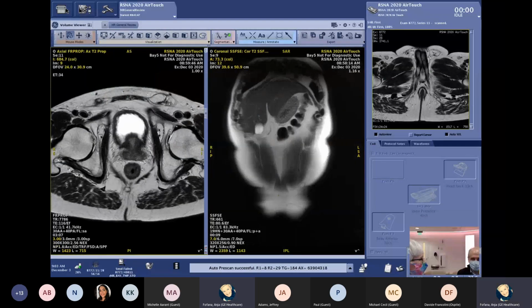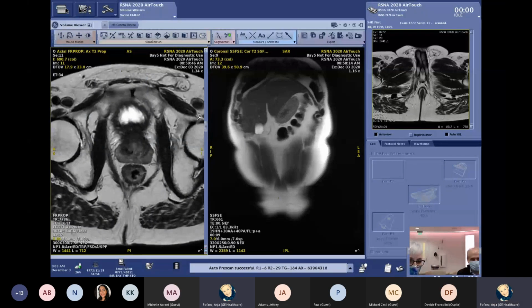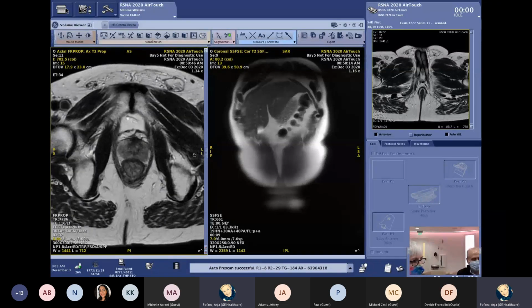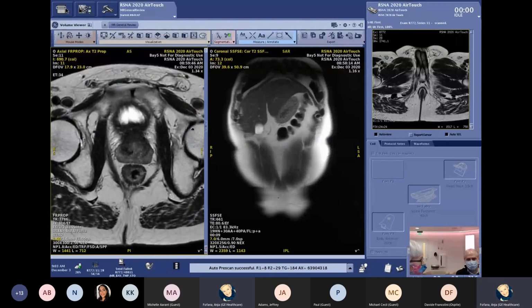So now here is the last scan of the prostate, which we did. There was a 3-minute scan time, and I will zoom in a little bit more. So all done, as we said when starting in the brain and ending in the prostate, only 3-minute scan time, and we are on 1.5 Tesla. We shouldn't forget that as well.